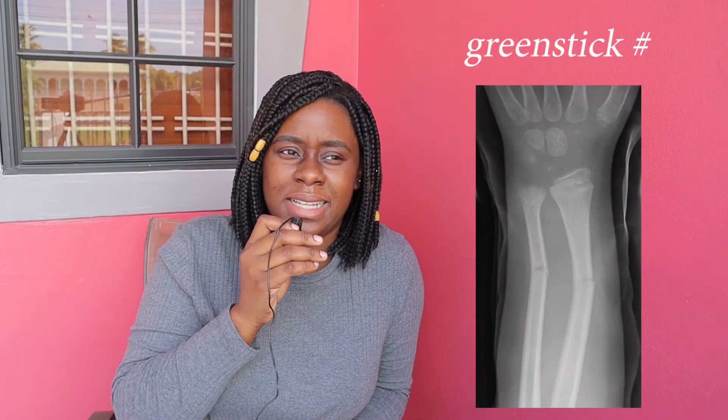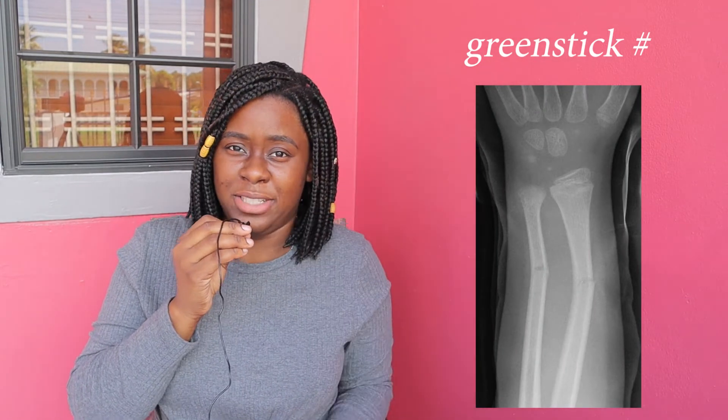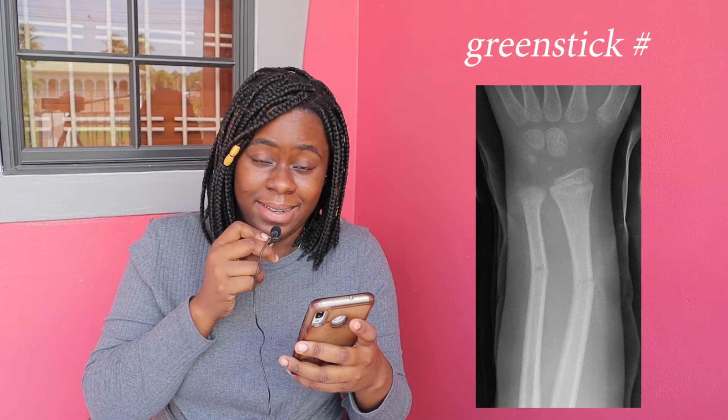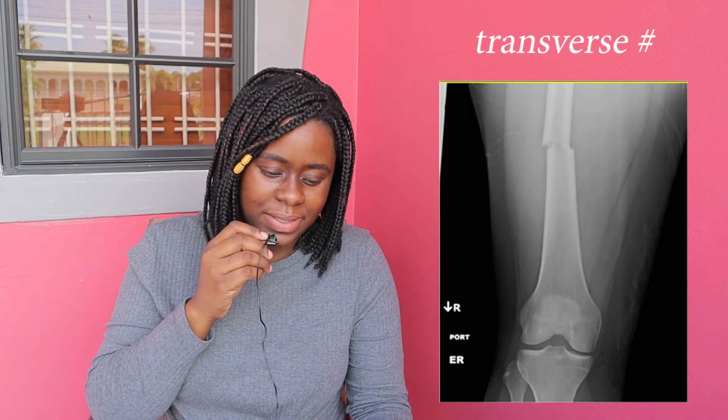As I was saying, this greenstick fracture is a common fracture in pediatric patients, but you must vet the history and make sure it adds up, otherwise it could be a sign of abuse. This fracture usually results from trauma, and in this case it involves both the radius and the ulna.